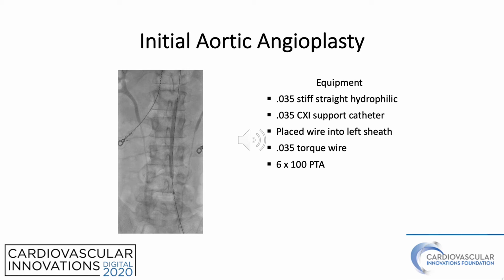Certainly at that time it would be reasonable to go ahead and, if you did not have a CTA, check the amount of calcium and whether you're luminal or subintimal, making sure exactly where you are in this procedure.